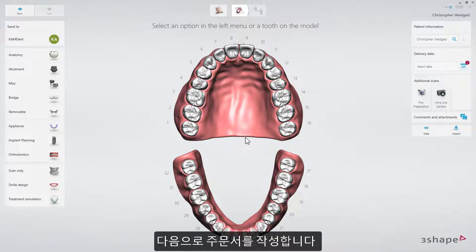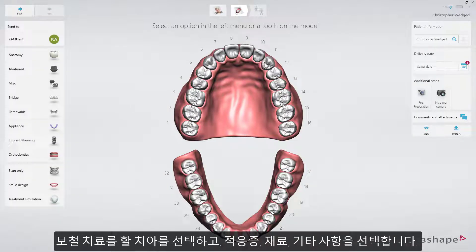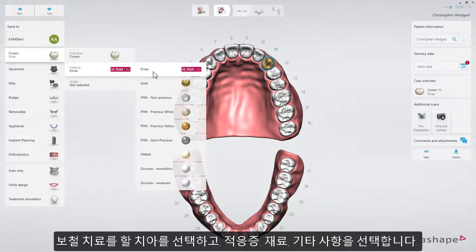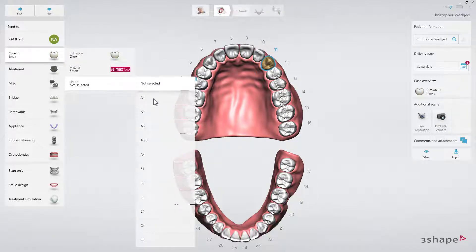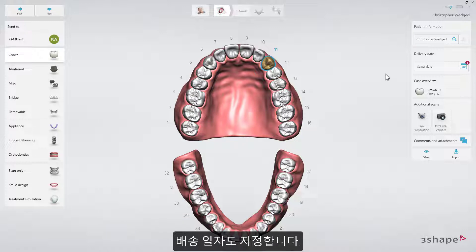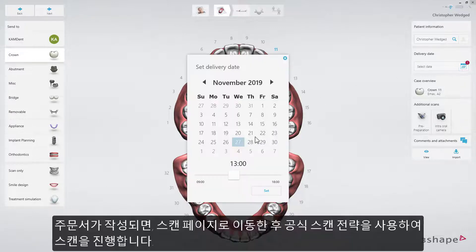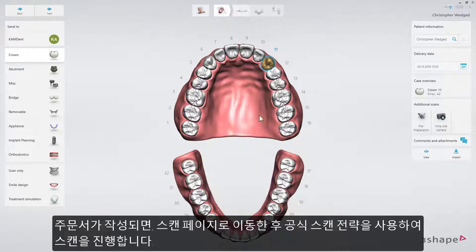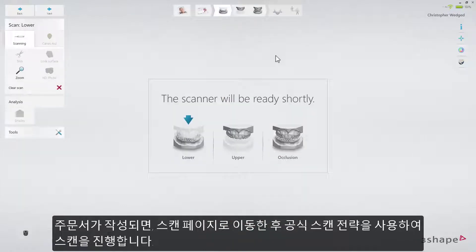Then fill in the order form. Select the tooth on which the restoration will be made, the indication, material, and other details. Set the delivery date. When your order is ready, proceed to the scan page, and make scans using the recommended scan strategies.